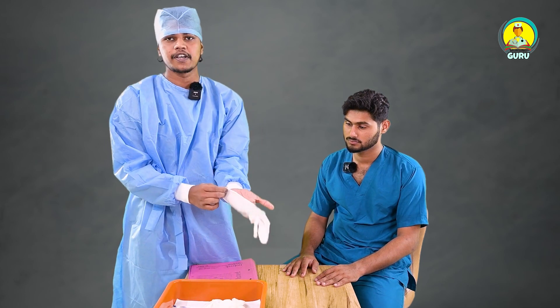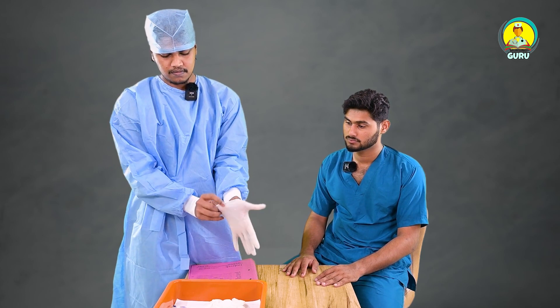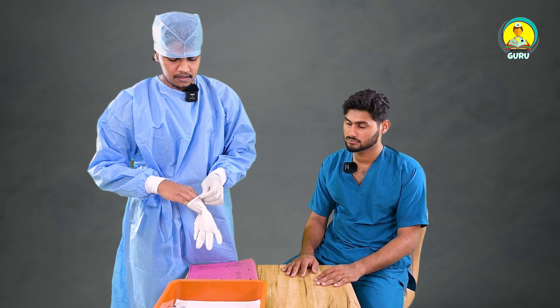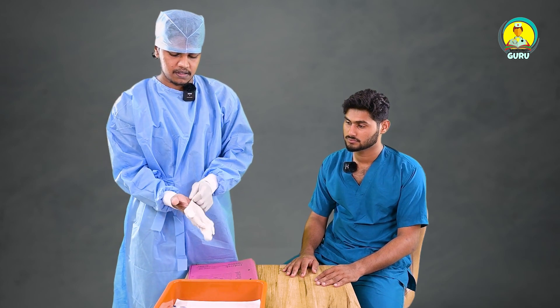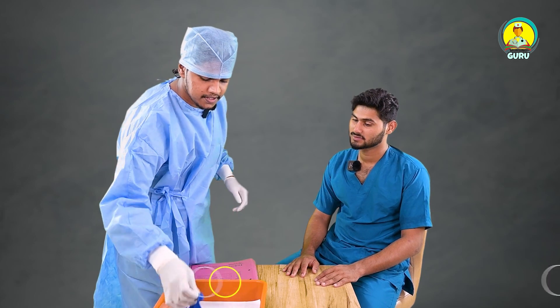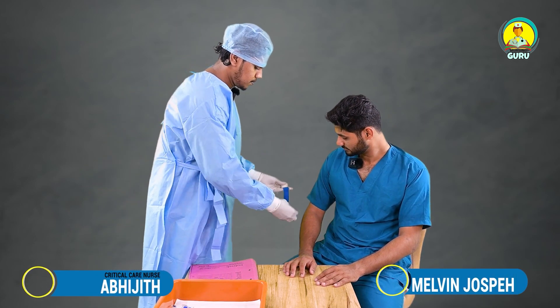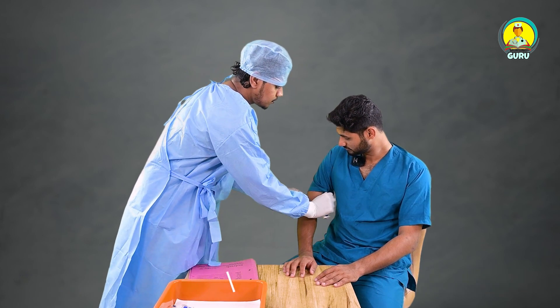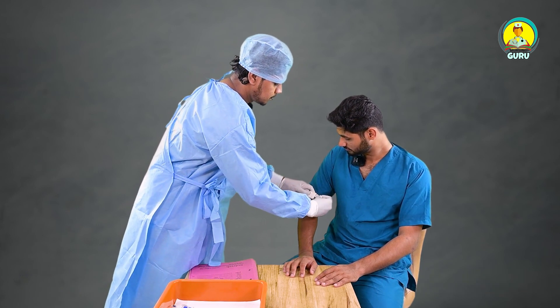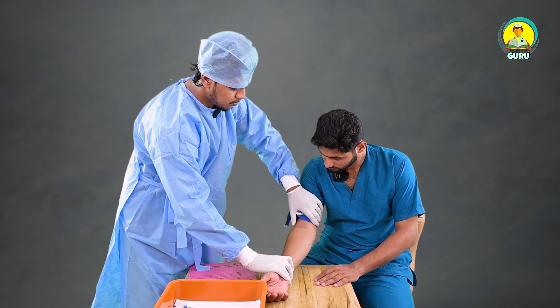First we need to wear gloves. Hi. Don't be panicking, it's just a small prick. Okay. Sit freely, it's just a small prick.